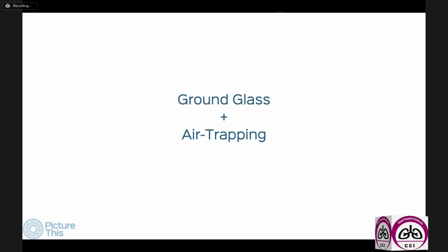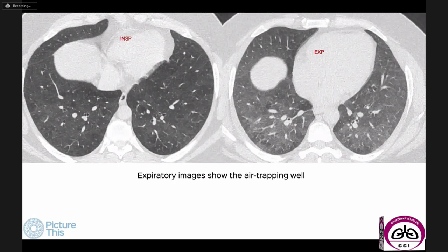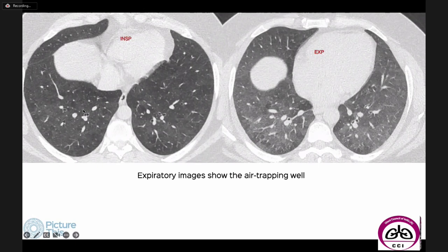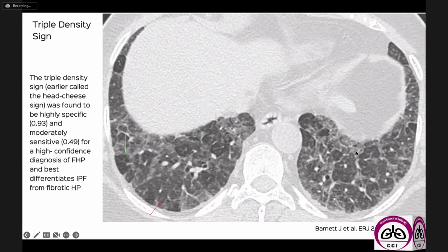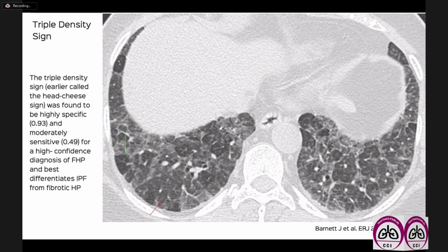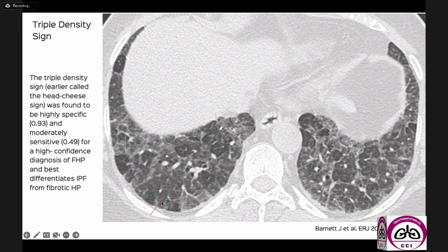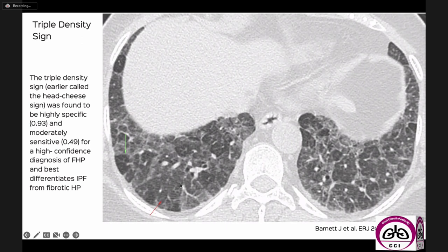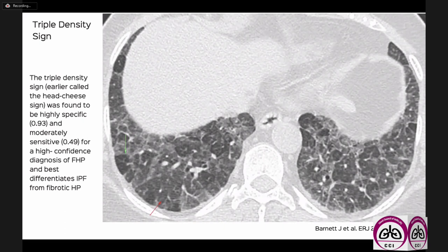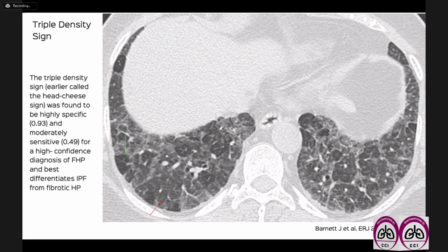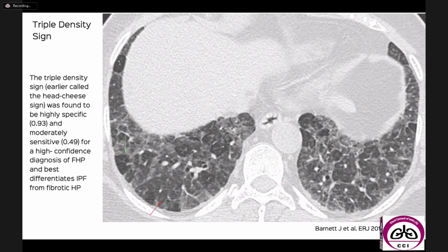We have the entity of ground glass plus — ground glass associated with other findings. When ground glass is subtle and ill-defined with lobular areas of air trapping, this typically occurs with hypersensitivity pneumonitis. This brings us to the triple density sign — formerly called the head cheese sign — where on an inspiratory image we see ground glass, normal lung, and lucent lung as three densities simultaneously. In the right clinical setting, the triple density sign is quite specific for hypersensitivity pneumonitis, where there is both a fibrosing and non-fibrosing component.